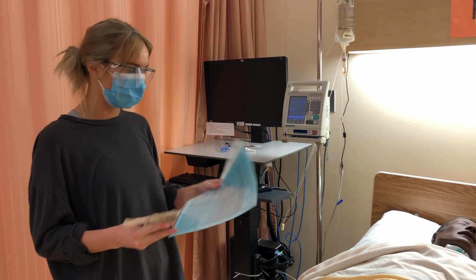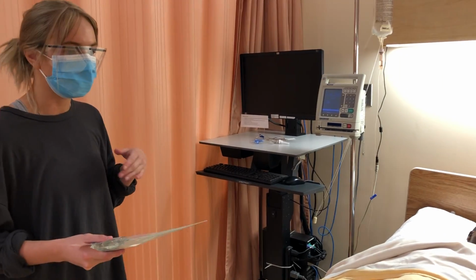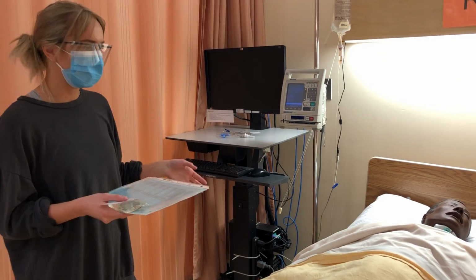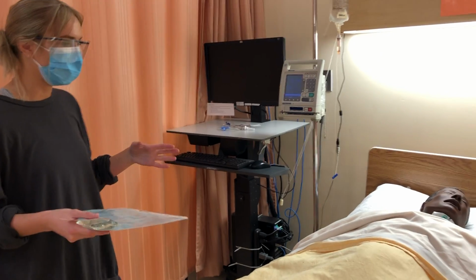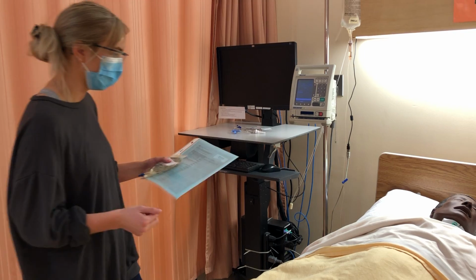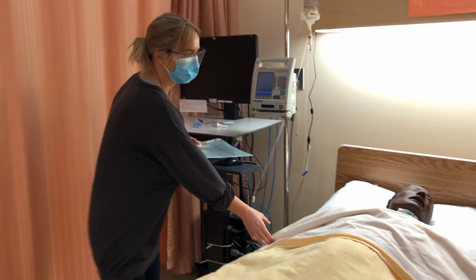So I'll be frequently monitoring that and your vital signs. If you've experienced any signs of hypoglycemia, like sweating, dizziness, tremor, anything like that out of the ordinary, be sure to let me know. And I'll be constantly checking for that too. So I've done my hand hygiene as well when I walked in the room.